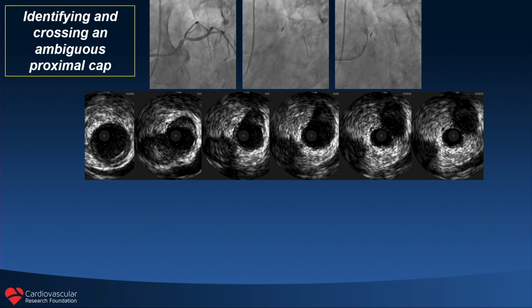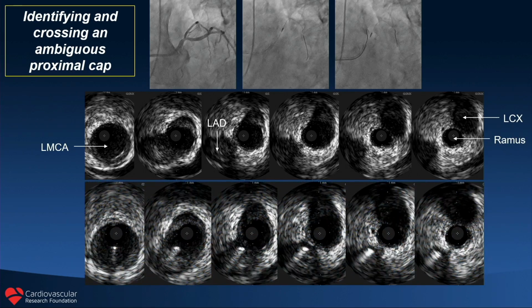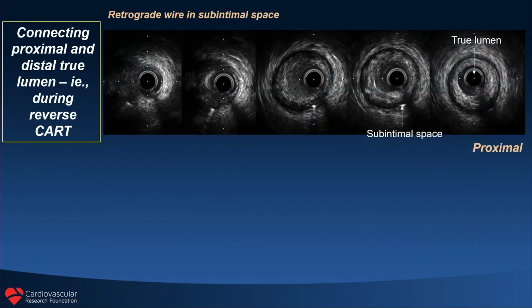This is an open vessel. This is what an occluded vessel looks like. And by wiring, you can determine where your wire goes and actually confirm that you're in the LAD as you're crossing. And so as we go forward, this just has a build on the slide. Here's the wire, and now we see the wire is actually in that occluded LAD segment. So this is a pretty useful technique for larger proximal vessels where you can pass the IVUS catheter into an adjacent side branch.